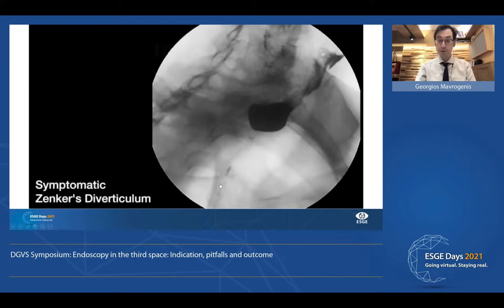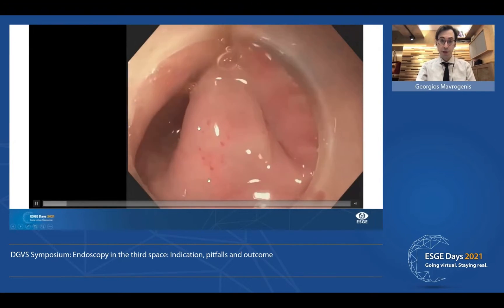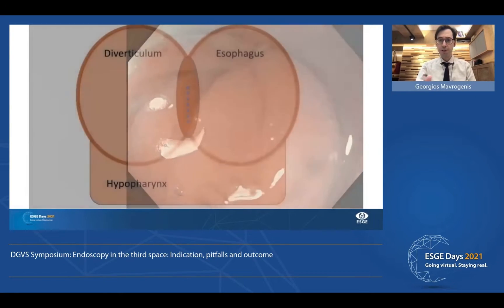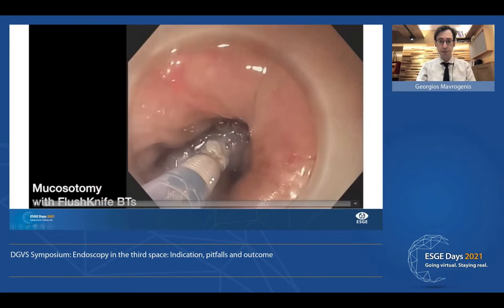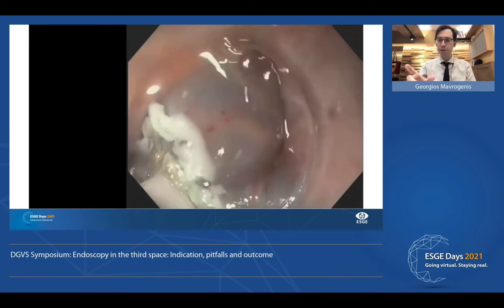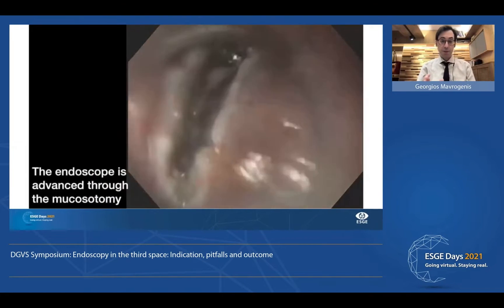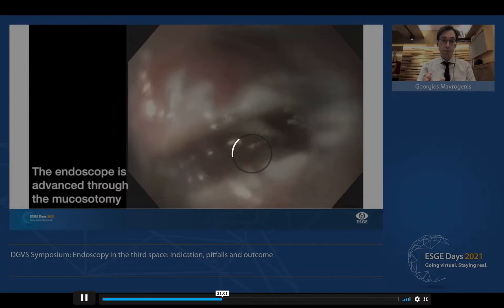This is the case of an 83-year-old patient with a two-centimeter diverticulum. The first step is to isolate the septum. We do submucosal injection with liquids similar to those used for ESD or POEM. Then, once we create the entrance with our knife, we push our cap, rotate the endoscope, and push it into the opening. The entrance has to be about one centimeter in size — we don't need to make a big hole. Once the entrance is created, we identify the septum.